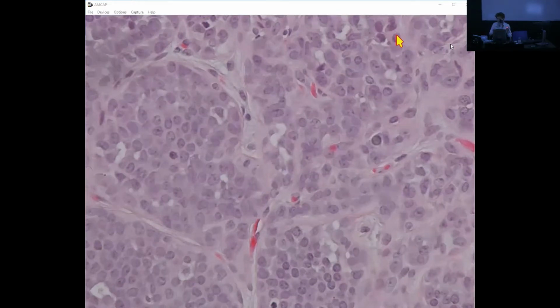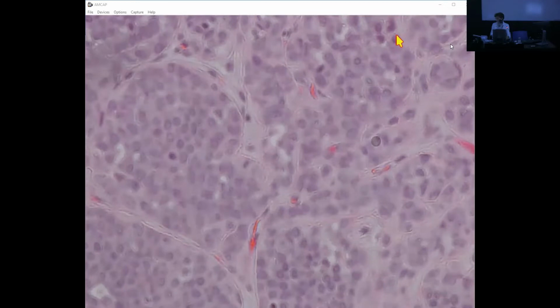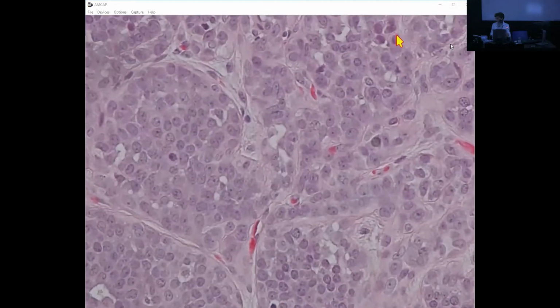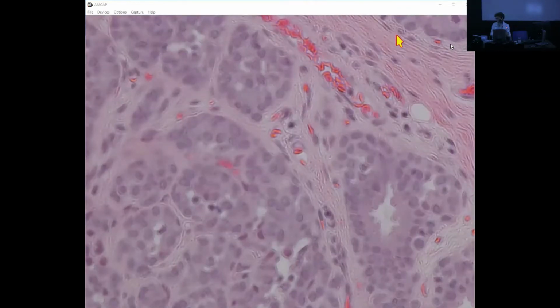In these cases where you have ADH, low-grade DCIS, tubular carcinoma, ALH, classic LCIS, flat epithelial atypia, it's really a whole family of lesions that all look the same in the nucleus. They're all related, but with different extent and different cell morphologies, like a big Italian family with many cousins. That's what I say sometimes. They all look the same, in a big Italian family, or any big family.